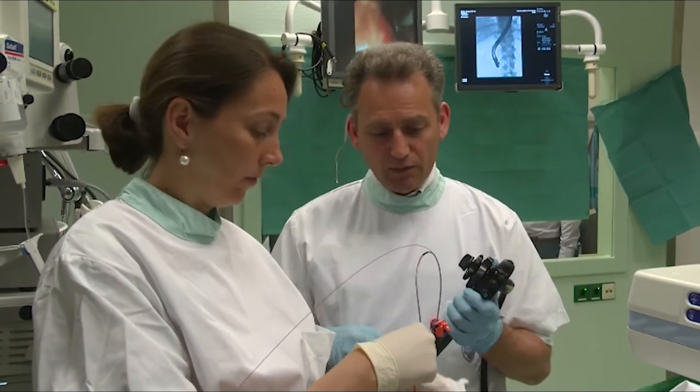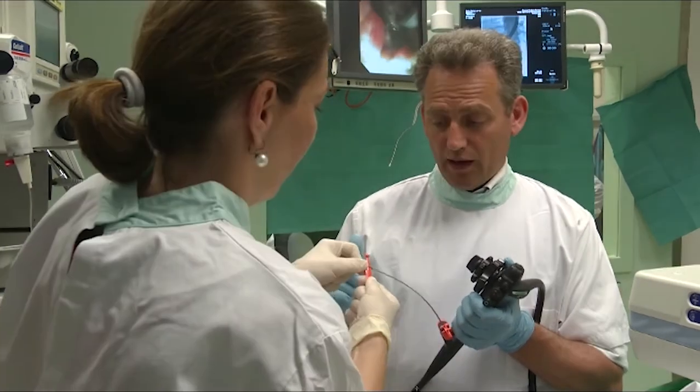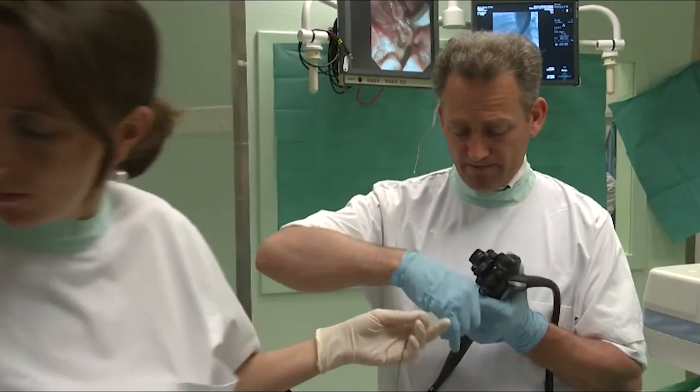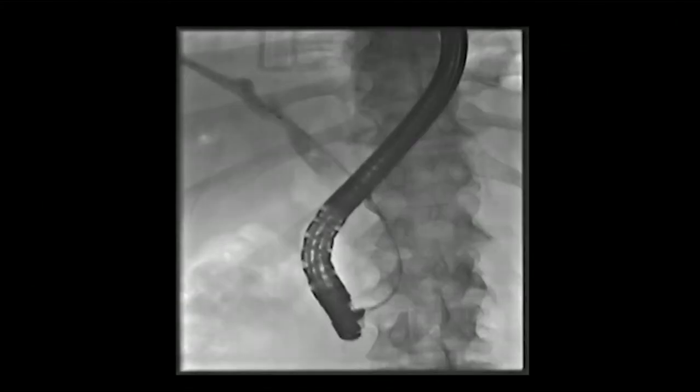Okay, we'll now split the wire and fix the wire to the locking device. And then we will make a pull-through cholangiogram to accurately document the distal stricture. So we'll now fill the common bile duct with contrast.